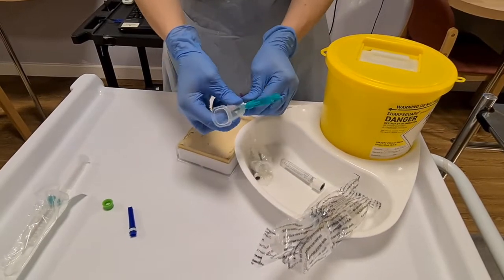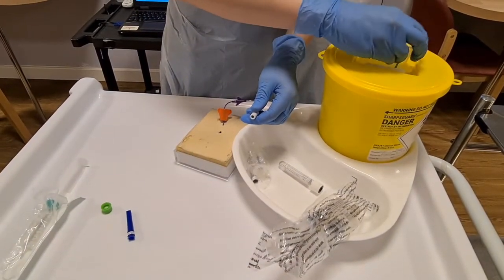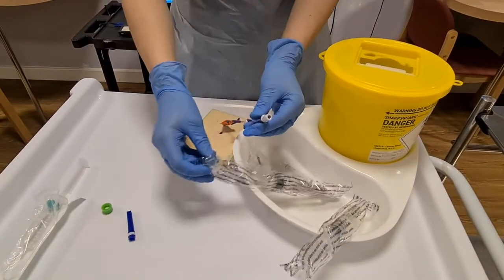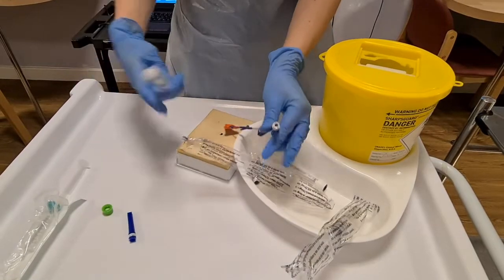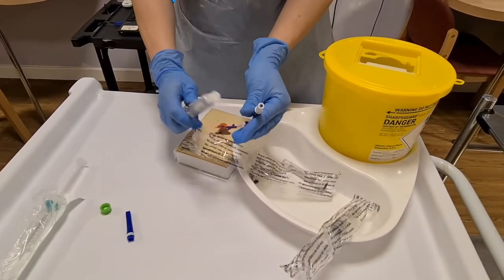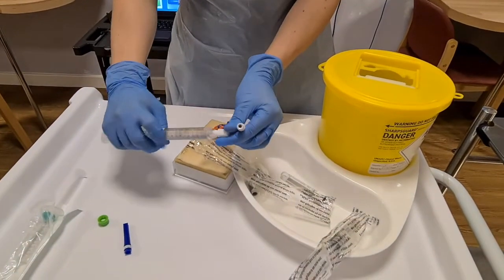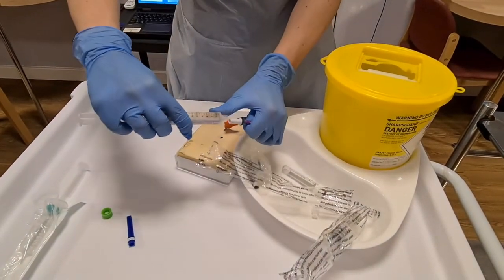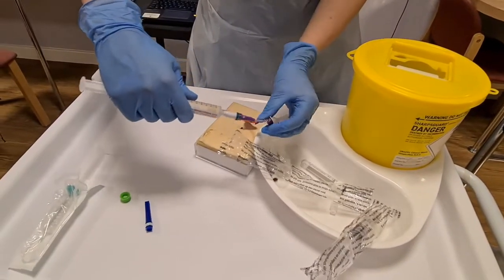Once you've got all the blood that you require, place this directly into a sharps bin. And then you need to make sure that you are flushing your PICC line. So with PICC lines, you always want to be flushing 20 mils after taking blood. So connecting it on and then flushing. Always use push-pause technique.